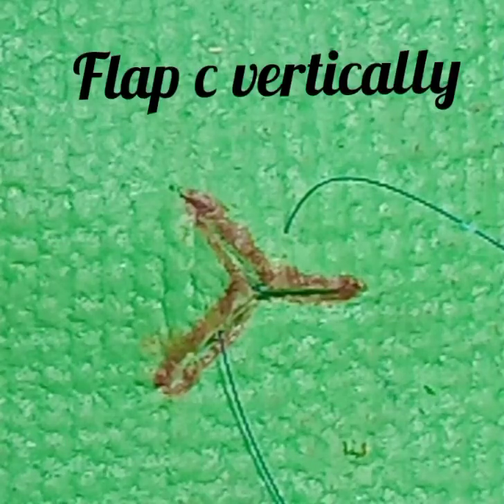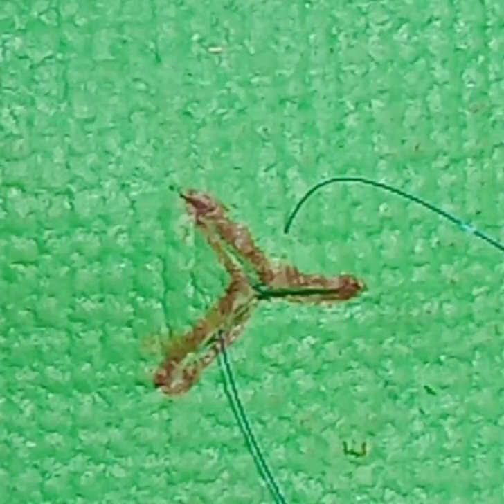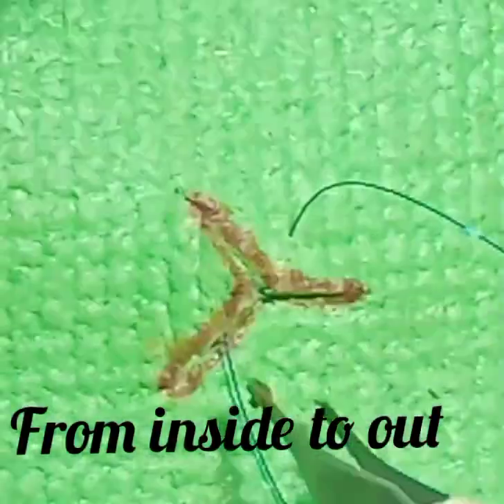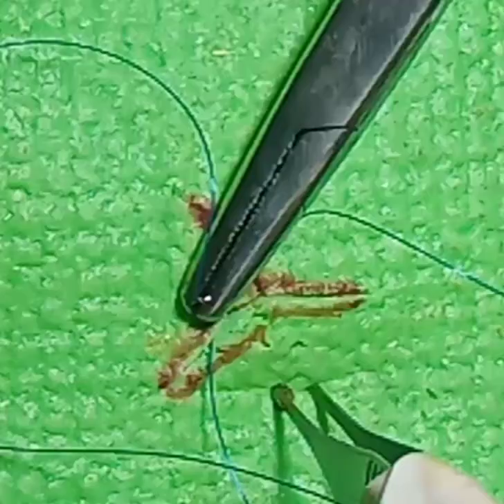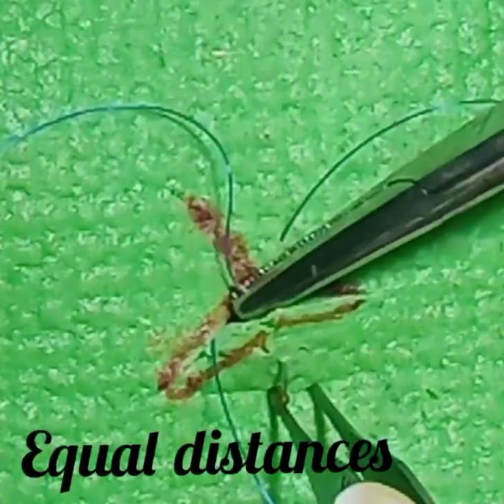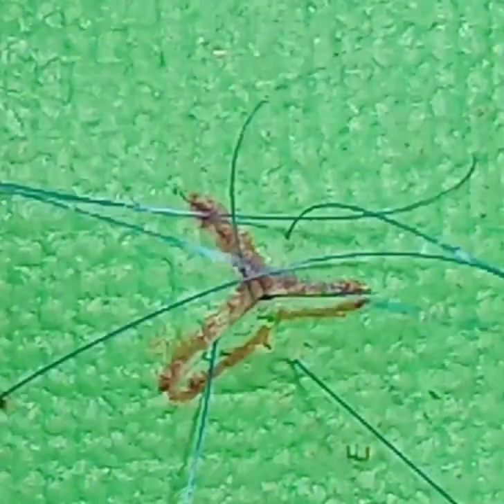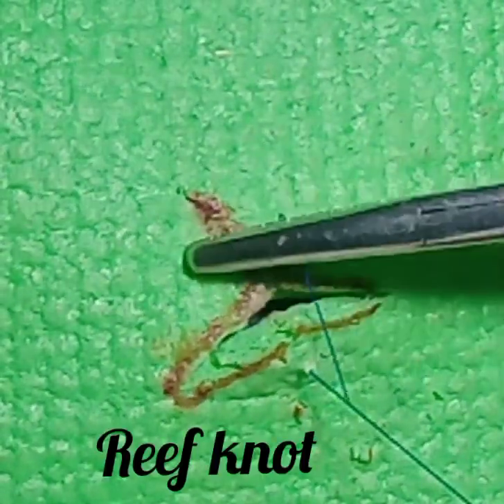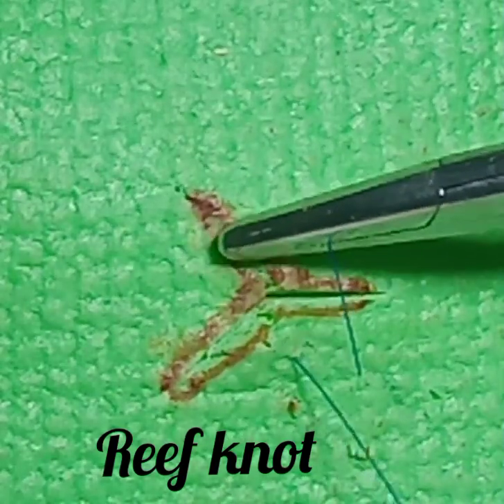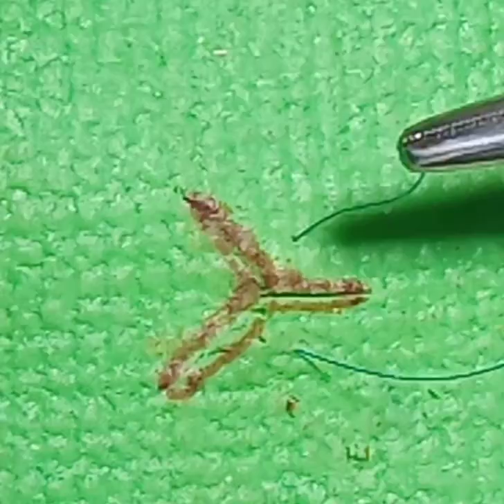Then again from the third flap, go vertically from inside to outside at equal distances from the edges. Finally, tie a reef knot or a square knot.